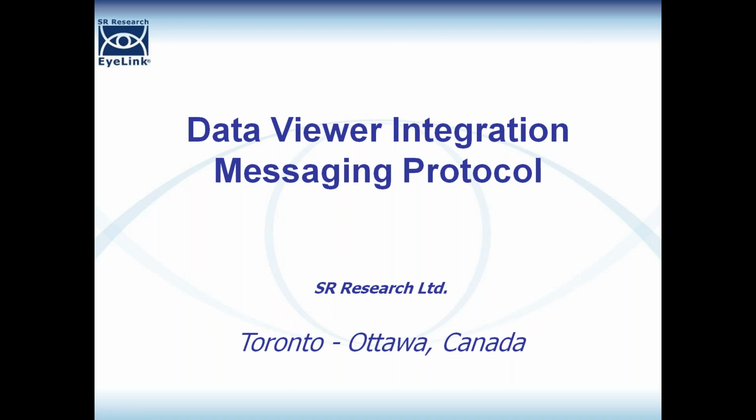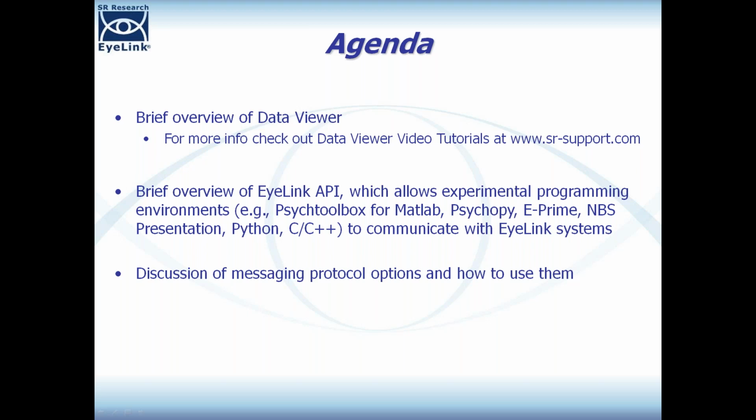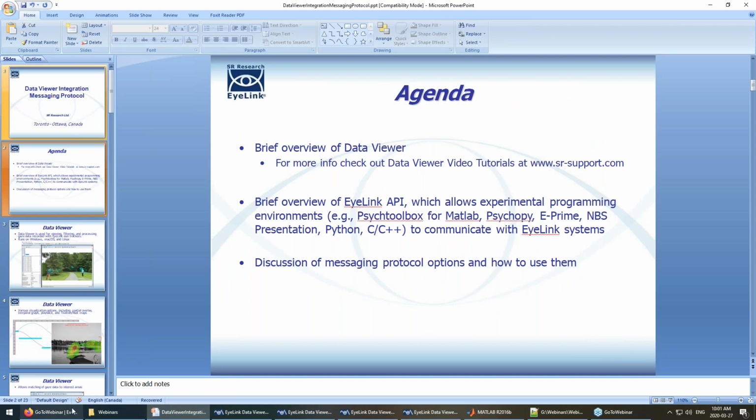Let's go here. In this webinar, we'll start by giving a very brief overview of Data Viewer. If you'd like more information about that, you can check out our Data Viewer video tutorials at our support webpage. Let me just exit out of this quickly and show you what I mean by that.